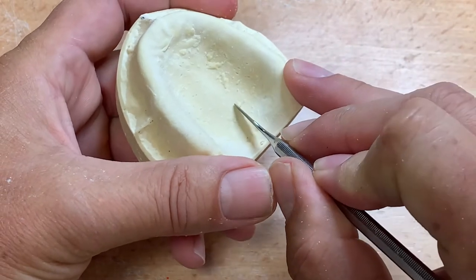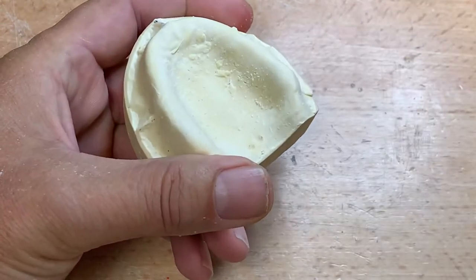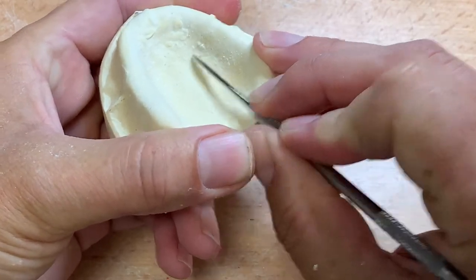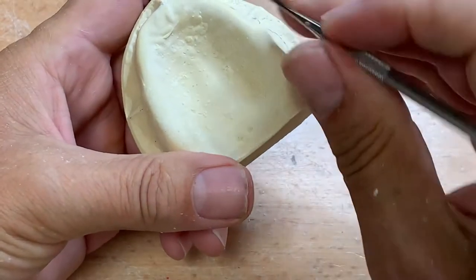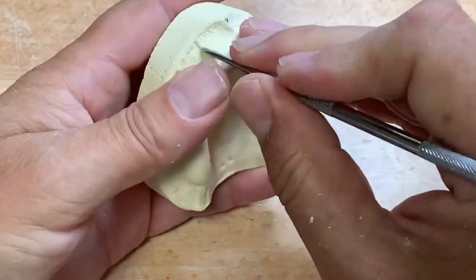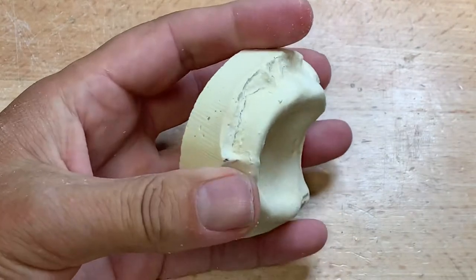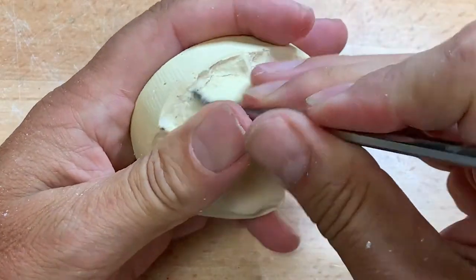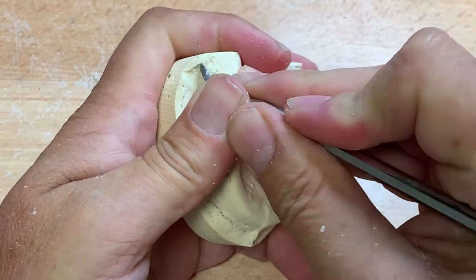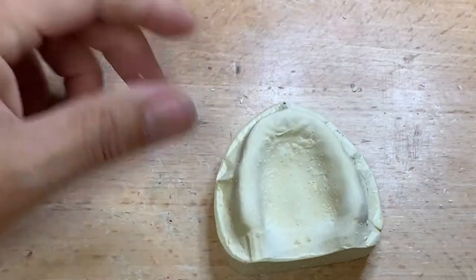On a preliminary impression, it would be okay to eradicate these bubbles with an instrument. You can use your number seven, Hollenbach instrument, or LeCron, and try to eliminate these small bubbles. If there are some in the sulcus, you can estimate where the sulcus is. I have one way back here — I'm just going to take the bubble off.